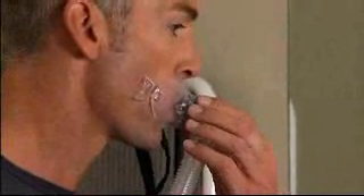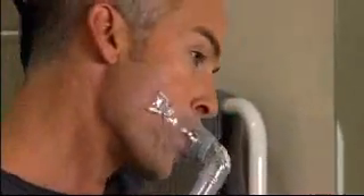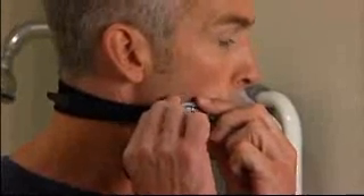Adjust the mask tightness by rotating the grey dial until the mask feels secure around the lips. With the headgear sitting loosely around the base of the neck, connect the other clip. Adjust the headgear using the velcro tabs to remove the slack.